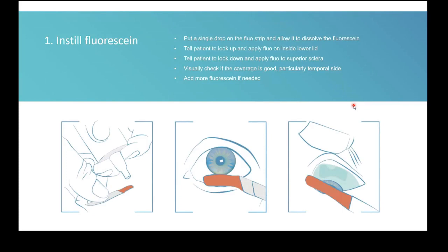It is important to use much more fluorescein than you do with your classical approach when you're using a slit lamp. So we recommend using 1 or 2 drops, really soak and wiggle the strip so it's absorbing all the fluorescein within the orange part, and instill it on the eye.